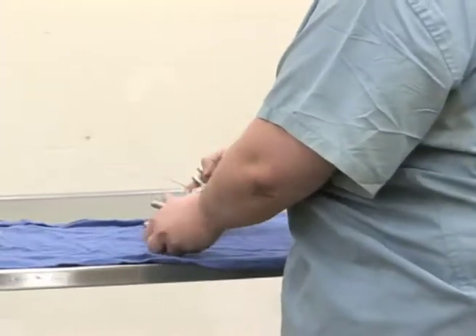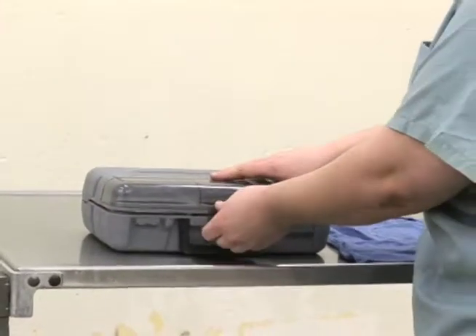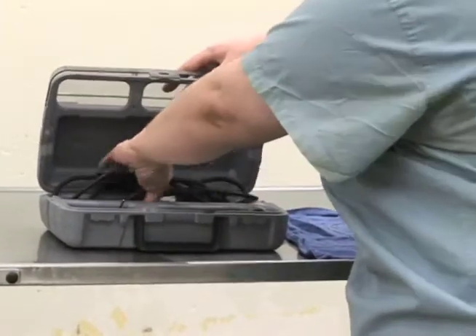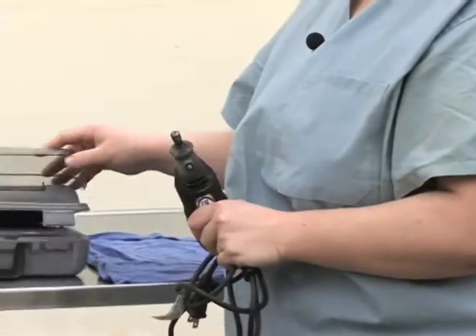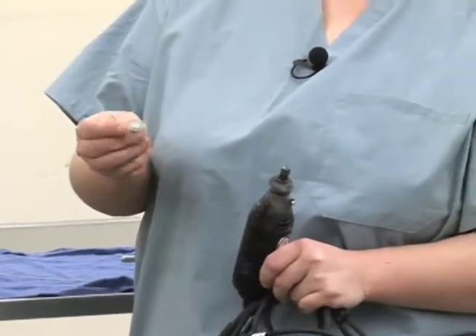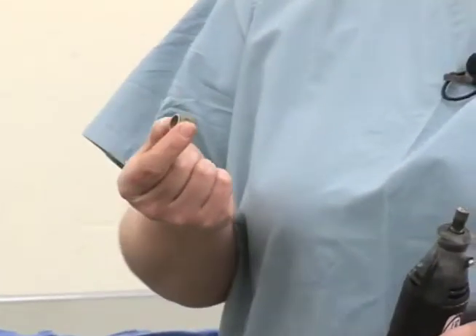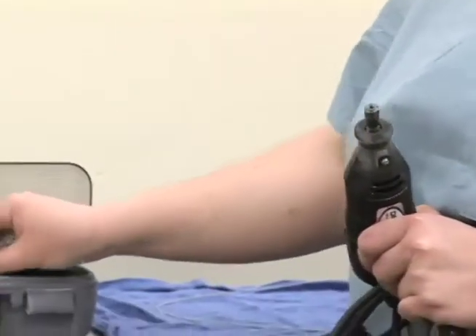The other potential option for removing fighting teeth involves the use of a Dremel type machine. This is something that's probably best performed if you have the animal sedated because of the potential for cutting the mouth if you're using it in an animal that can move very easily. We typically perform this with a circular cutting wheel as opposed to just sanding it down with something that's more of an abrasive surface, like sandpaper, although both techniques can be performed depending on how much tooth you need to remove.